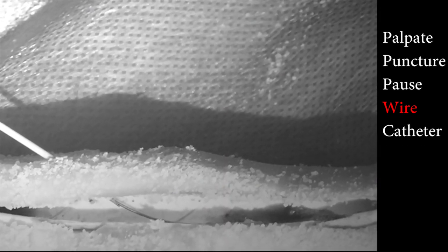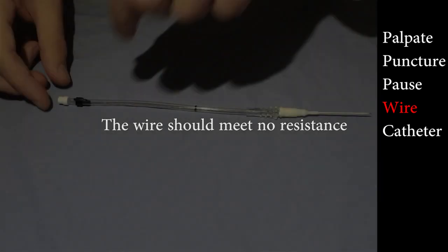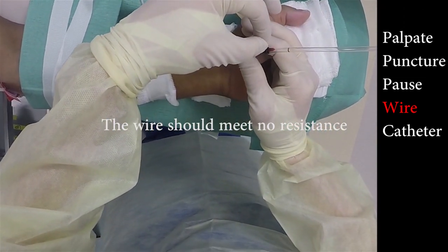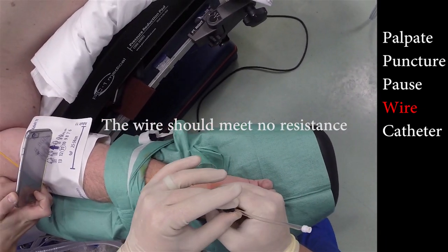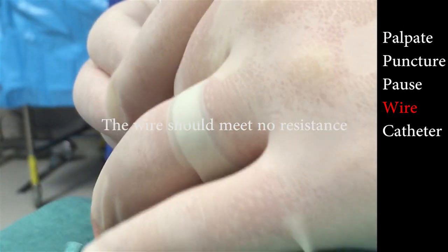It is normal for the column of blood to stop rising once you start moving the guide wire. It is never normal for the guide wire to meet resistance — this is likely to occur as the plastic handle passes the black indicator. Stop and retract the guide wire, check for the rising column, and make small movements backwards and forwards, again trying to insert the guide wire.